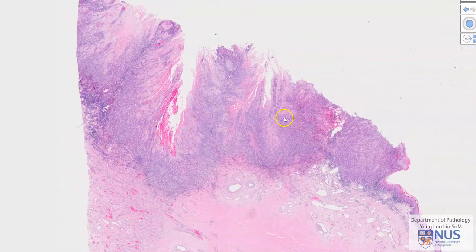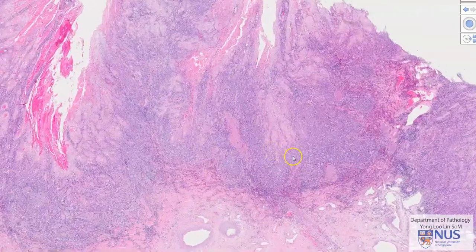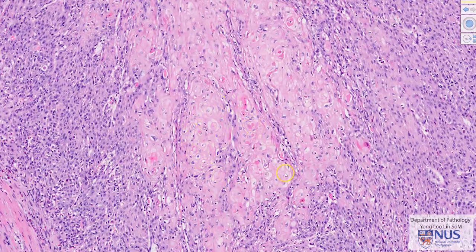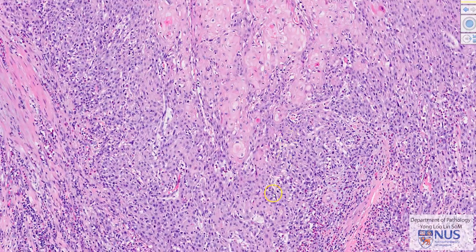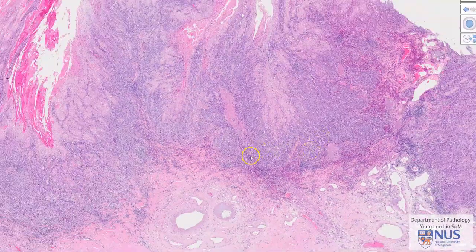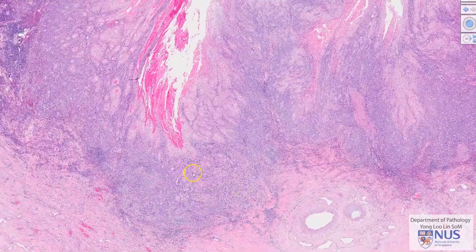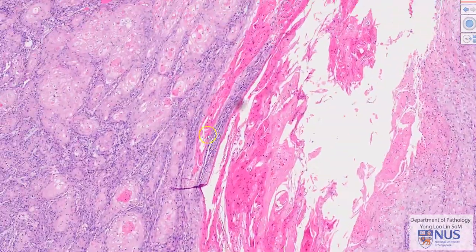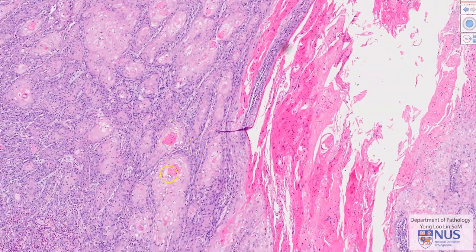In summary, this is a case of squamous cell carcinoma of the glans penis, which is composed of islands and sheets of malignant squamous cells. These squamous cells invade into the underlying lamina propria and into the corpus spongiosum. There are also areas of keratinization and keratin pearl formation, and these tumors tend to spread initially to the inguinal lymph nodes. Thank you.